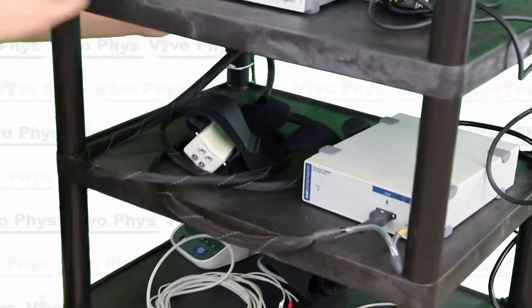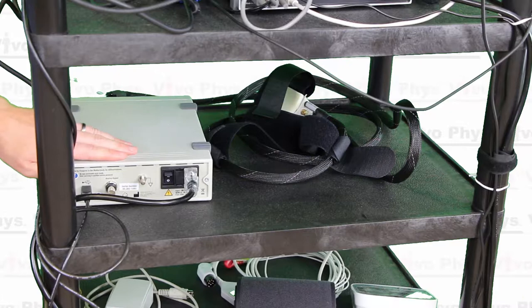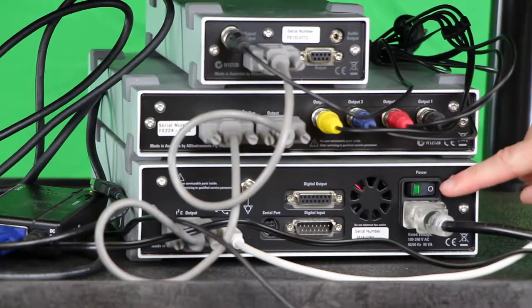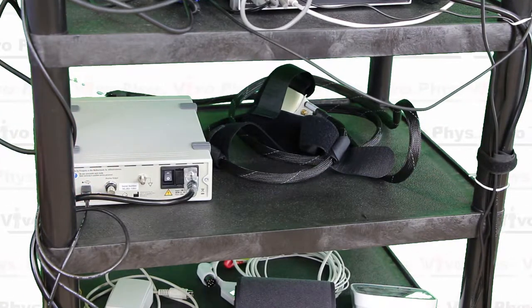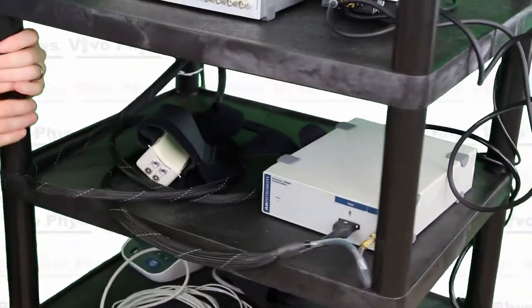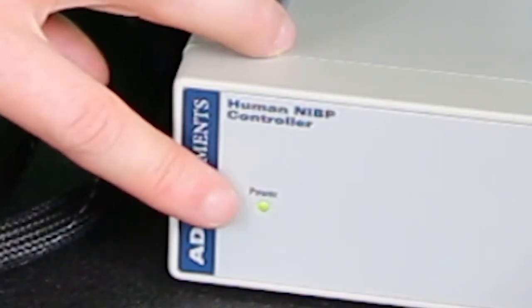Looking at the back of the NIBP device, we need to turn on the system. We also need to make sure the PowerLab system is turned on — that's a separate box. There's a black plug that converts to USB and plugs into the computer, and that's how the actual data gets from this device to the computer, where it's integrated using LabChart software. The green power light is now on.